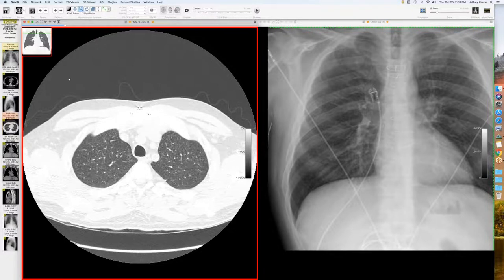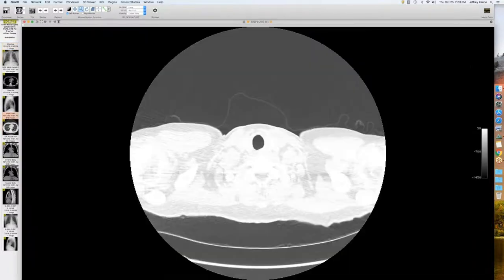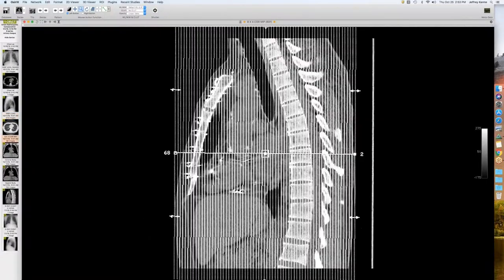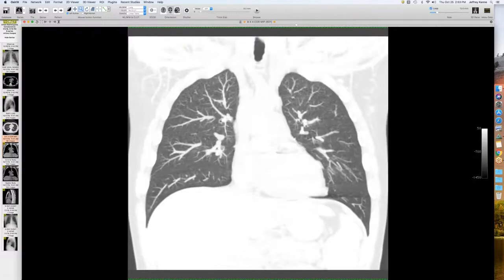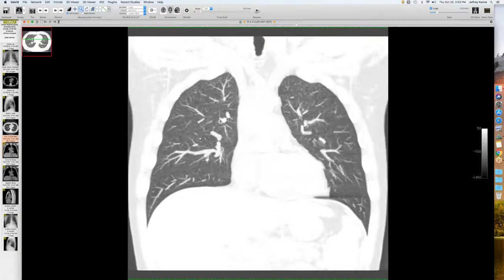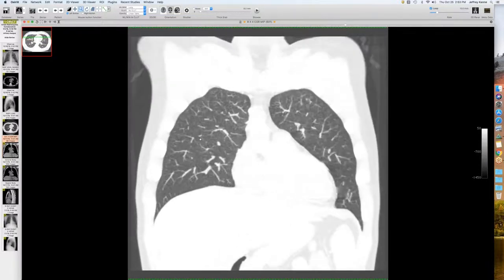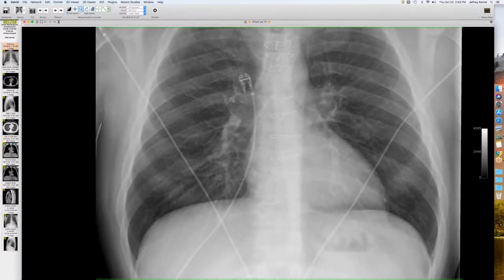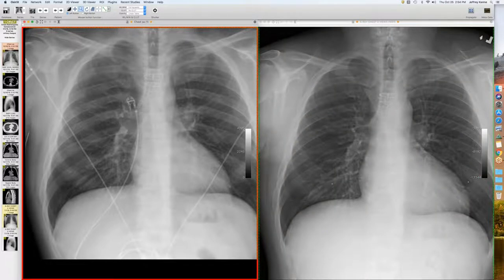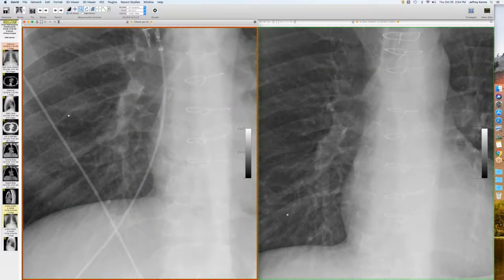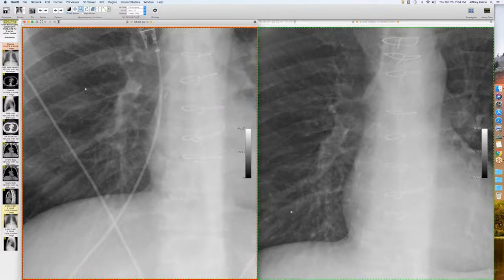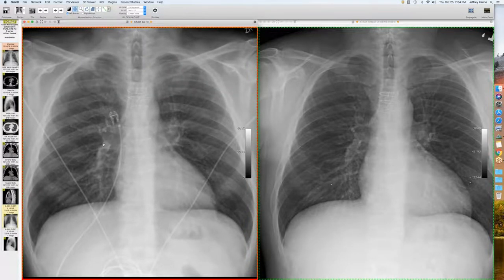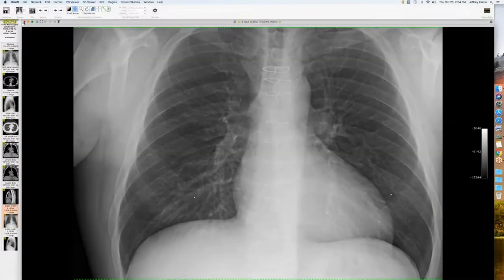This patient not only had a urinary antigen that was off the charts, but also had histoplasma in the bone marrow and in the bloodstream. So it's disseminated histo, and they're doing well now on IV antifungals. For histo, there's a urinary antigen and a serum antibody. These are really tiny nodules — probably P opacities, like a 3/3 on an ILO classification. They're really hard to see. Having the old one to put up side by side, you could argue the margins of the vessels are just a little fuzzier, but you'd walk right over this pretty quickly. This is miliary histoplasmosis in a kidney transplant recipient.